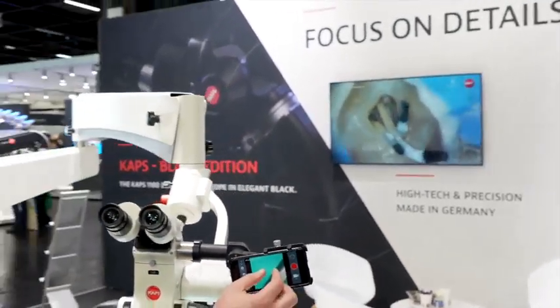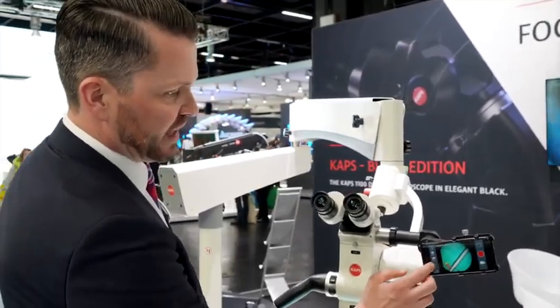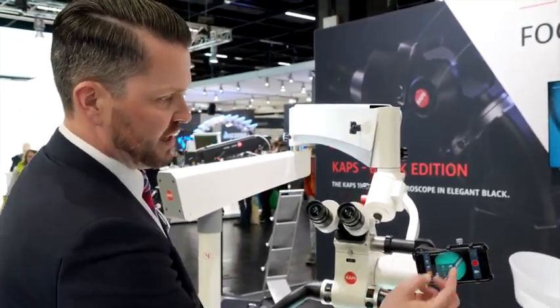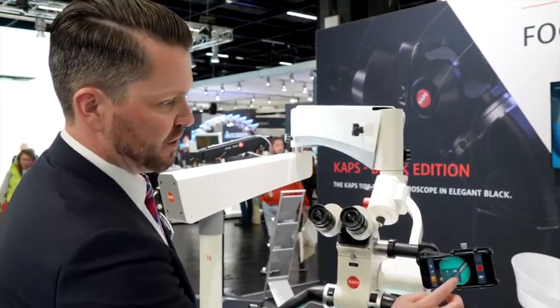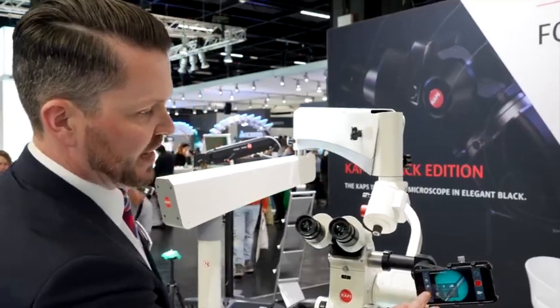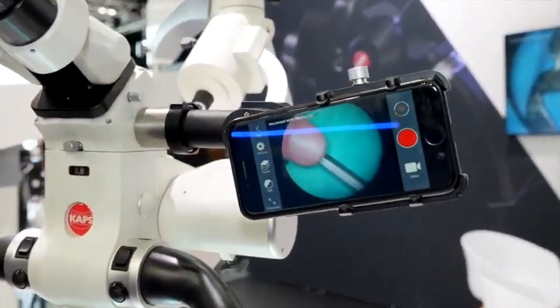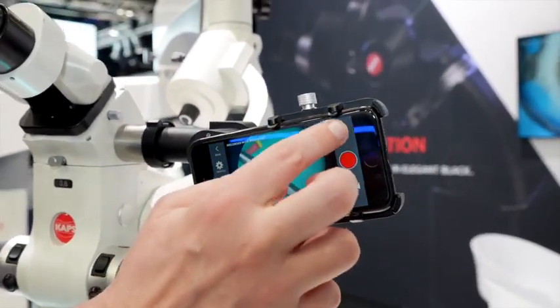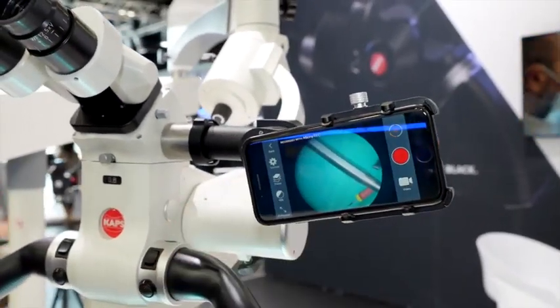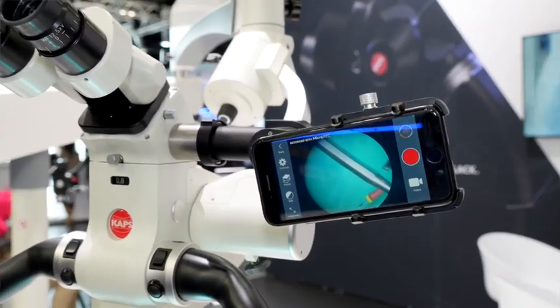We also have a nice application which allows you to run several features: adjusting the white balance in different modes fitting to the microscope illumination, like here LED. You can rotate the picture in 90-degree steps so that the picture corresponds to the microscope. You have a recording feature, you can take snapshots, and all these features are included in our new smartphone adapter.